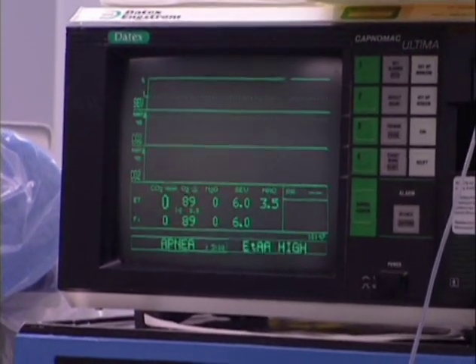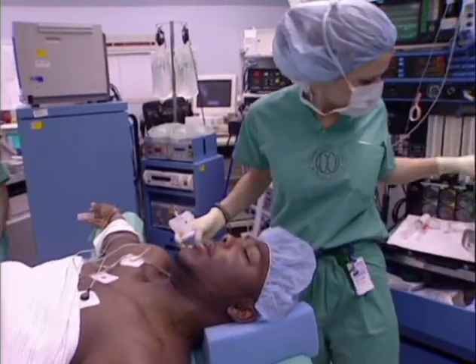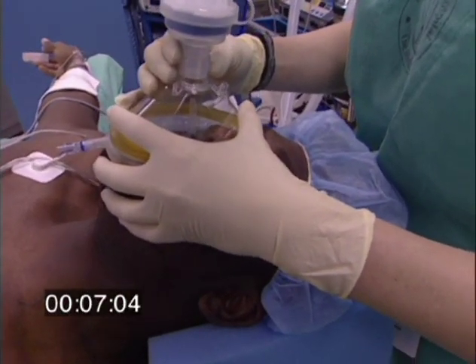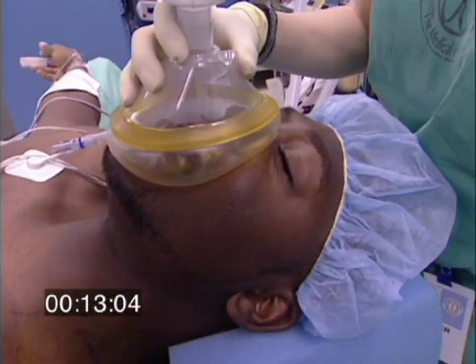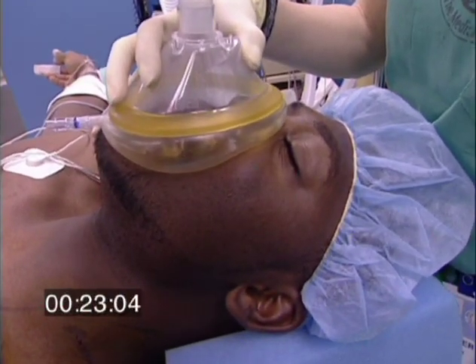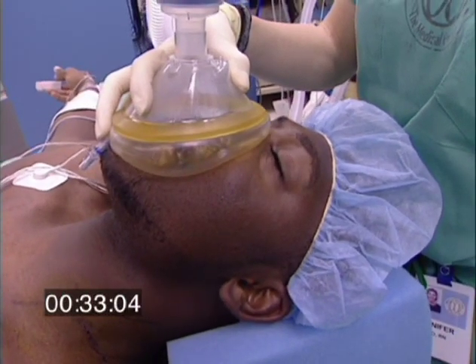All right, looks like we're ready to start. Take a deep breath in, and I want you to breathe it out completely and hold it. And hold it. Take a big, slow, deep breath in. Now hold it for a couple seconds. Okay, now exhale. Just regular respirations. Breathe in normal.